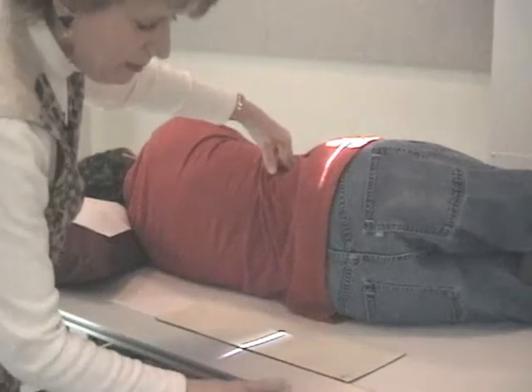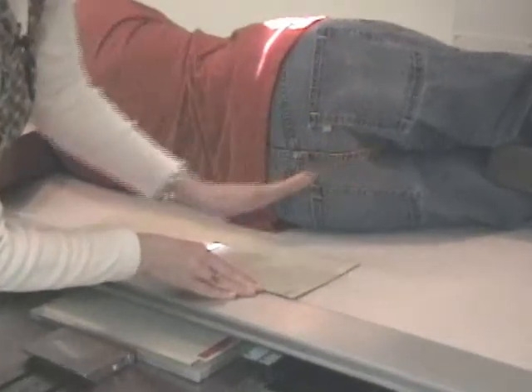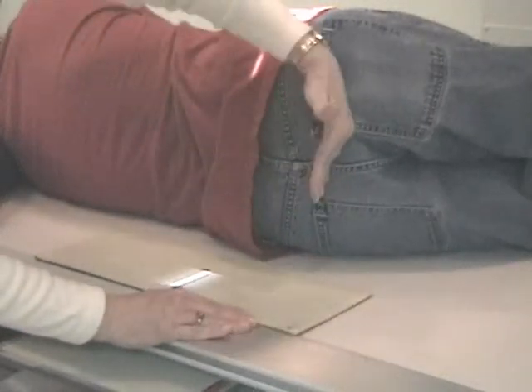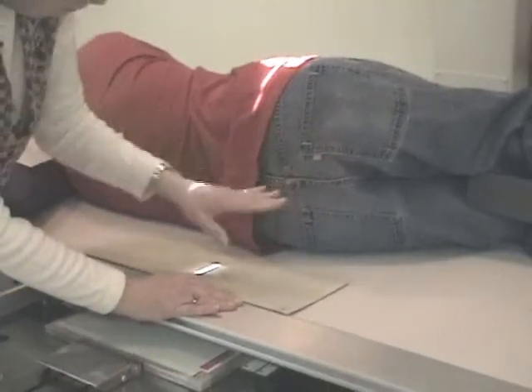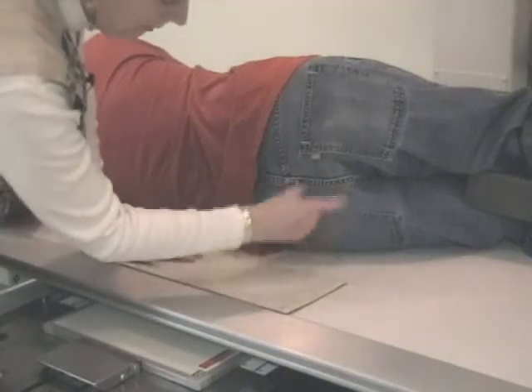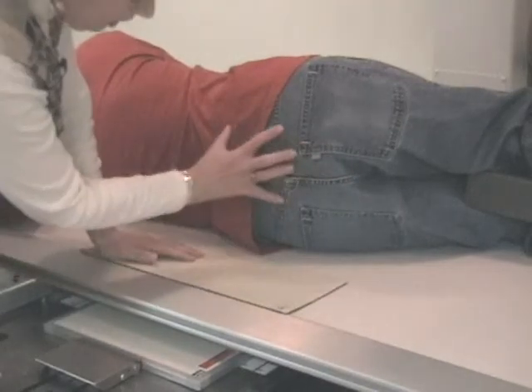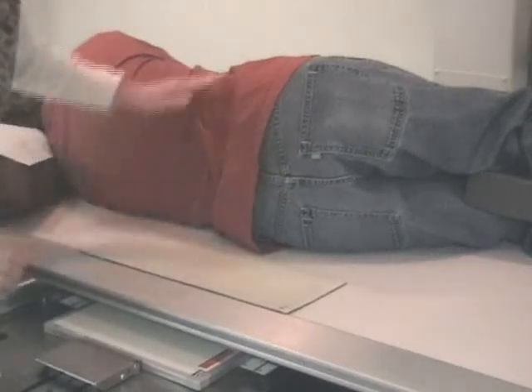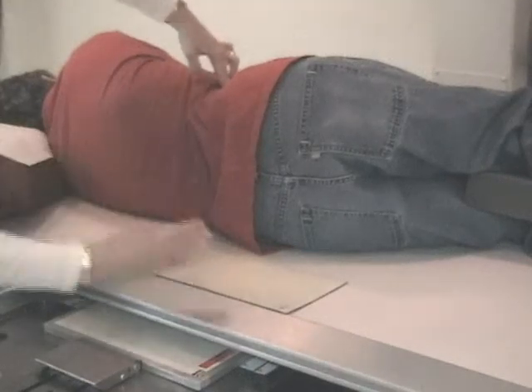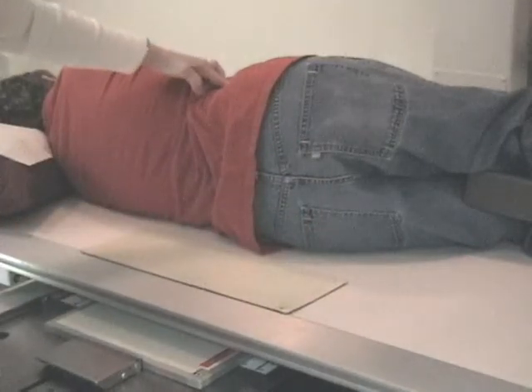But I like to look at the bottom edge of the film too. Okay, here's the bottom edge of the film. And you can look at the patient's buttocks. In a gown, Larry's pants are causing us a little problem here. But if you see that bottom edge of the film and you're x-raying tabletop, that should be an indication that you're too low. You need to be up over the sacrum and coccyx. But in today's demonstration, we're just fine. The film's edge is 1 inch above the crest. I look at the bottom edge of the film. I'm not x-raying too much tabletop, so I'm satisfied with that positioning.